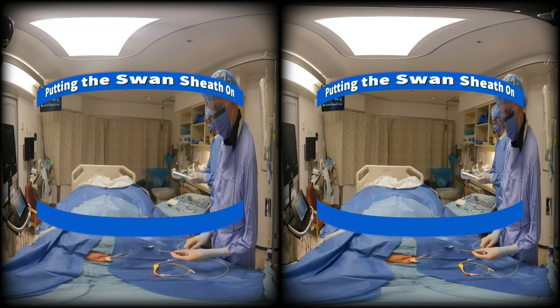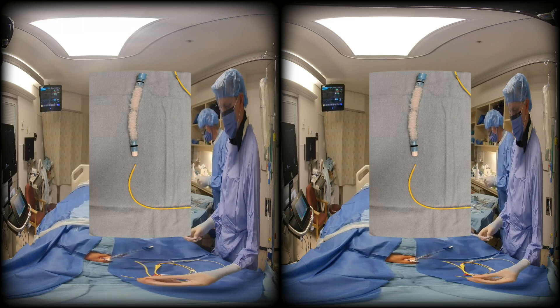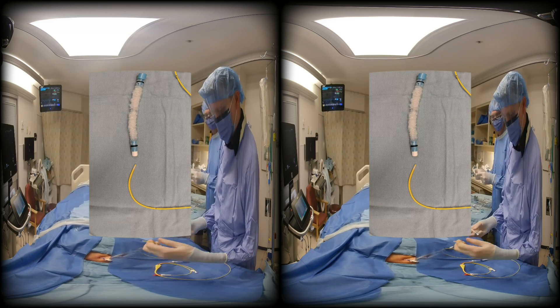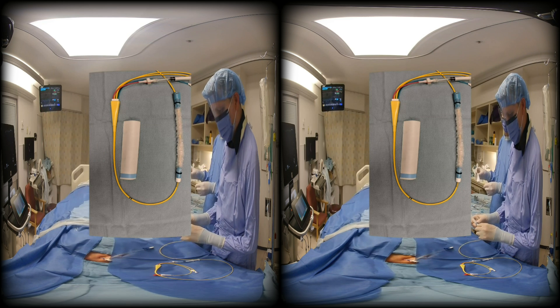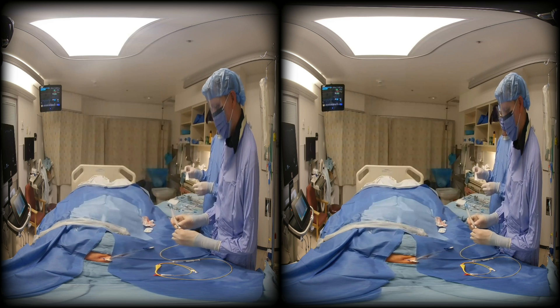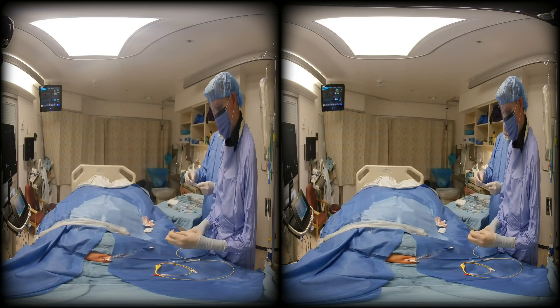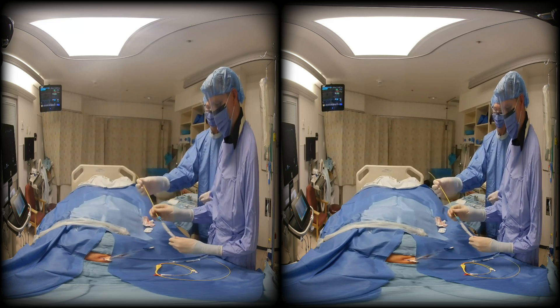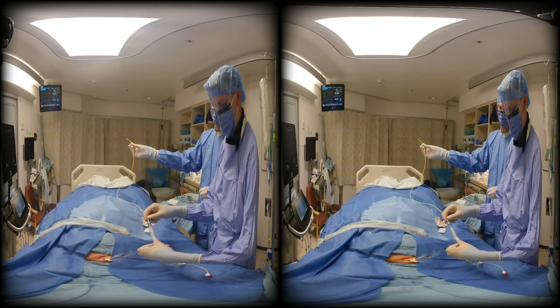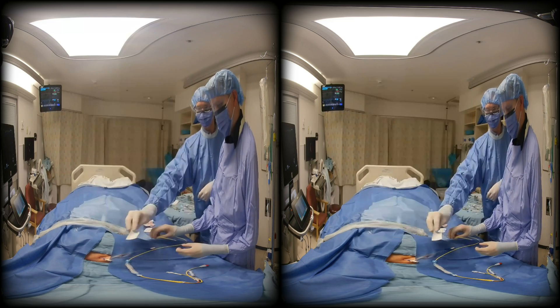Before inserting the swan, you need to protect it with the sheath. The sheath allows you to manipulate the swan and re-float it if necessary later. By the way, in case you were ever wondering, the official name for the sheath is the swandom. Insert the swan into the sheath so that the locking cap is on the distal end. Then secure the proximal line between 80 and 90 centimeters using the included tape.